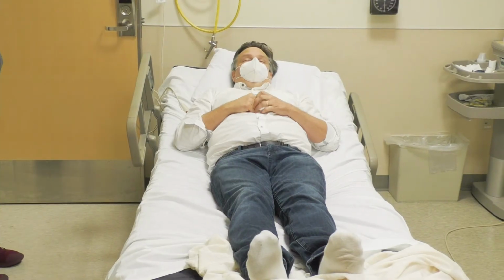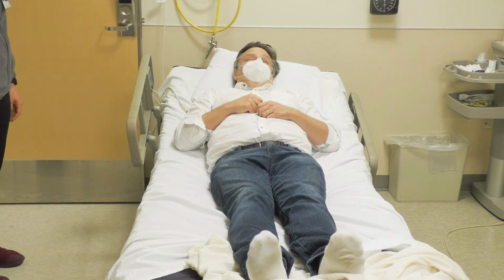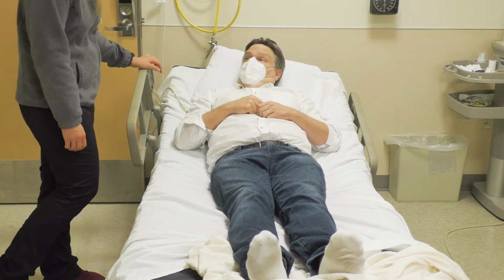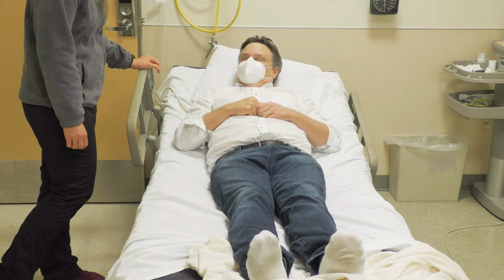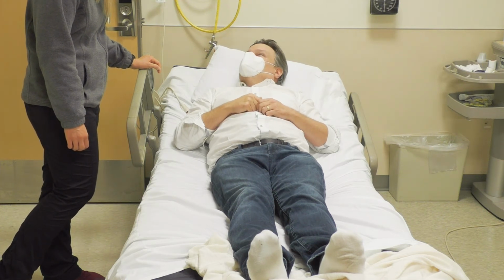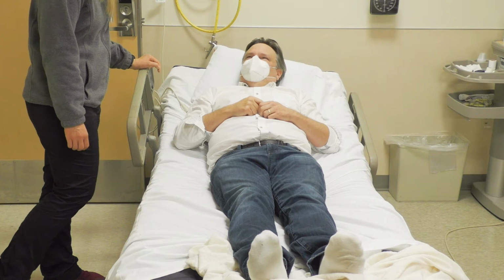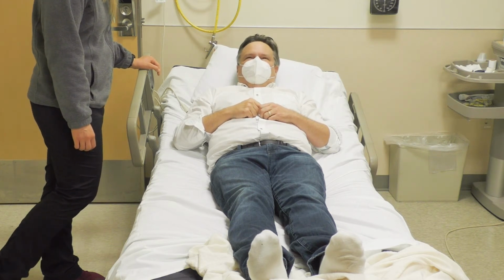Now you're going to do some clinical testing. Ask the patient the following. Remember blue elephant. Remember blue elephant. Ask them how they are feeling. How are you feeling? I don't know. Ask them their name. Can you tell me your name? Where are you? James, in a hospital. I heard it. Perfect. What's your birth date? June 24, 1970. Can you tell me why you're here? I think you're looking to see if I'm having seizures.